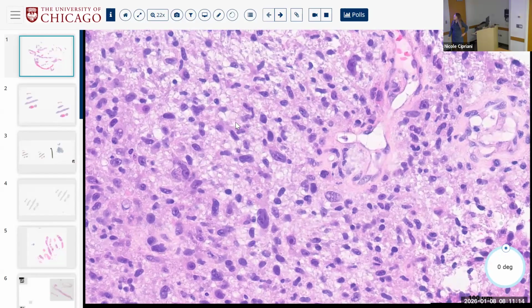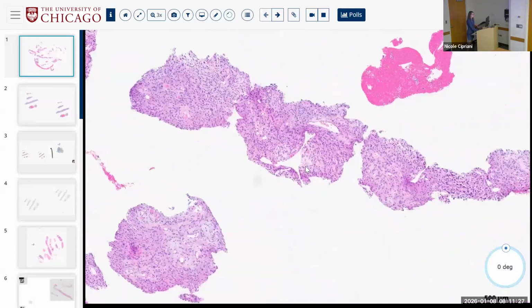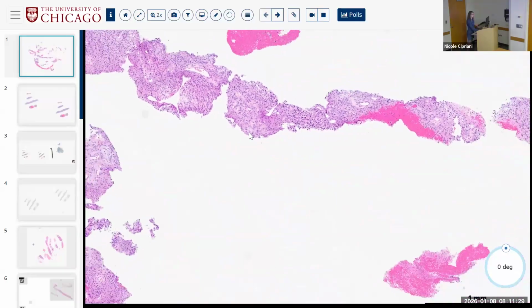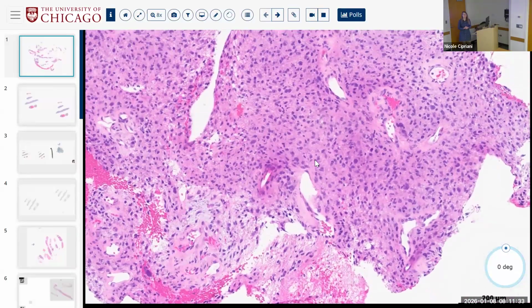Extracellular. Yeah. So when you perceive the vacuoles as not really being in the lesional cells, we favor less an adipocytic tumor. So if we're not favoring this to be an adipocytic tumor because the vacuoles are not intracellular, if we can't prove that it's dedifferentiated liposarcoma, what are we left with? Are there any other entities on the morphologic differential diagnosis for malignant mesenchymal tumors that you significantly want to consider?